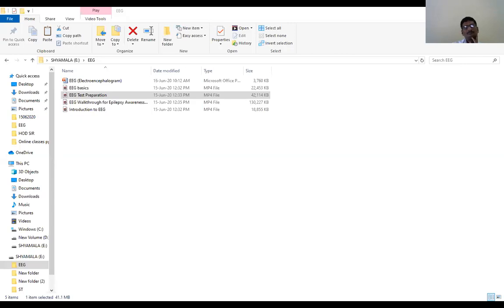The test is run on a computer that looks like the ones you have in your own homes and schools. We will be applying 25 electrodes and 2 EKG stickers to the chest to measure your heartbeat as well. The electrodes are 48 inches long and multicolored with a disc or cup on the end that is attached to the scalp by an adhesive method. This small disc is made of pure silver with gold plating over it.